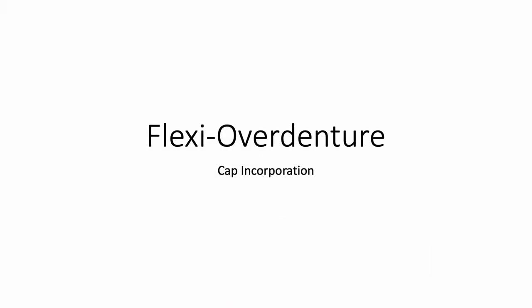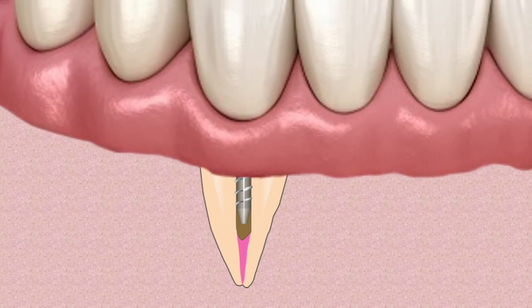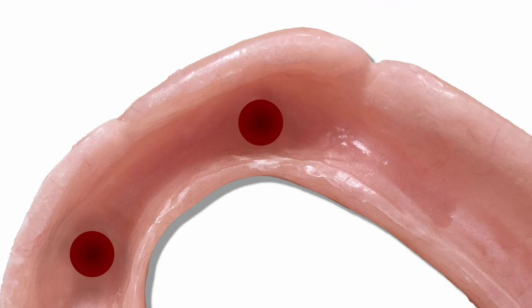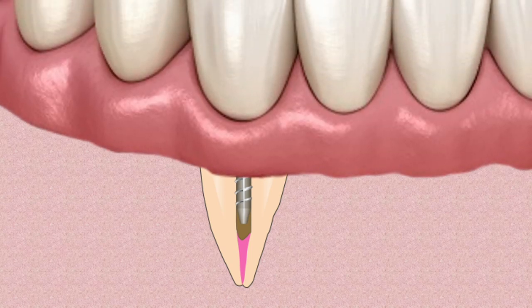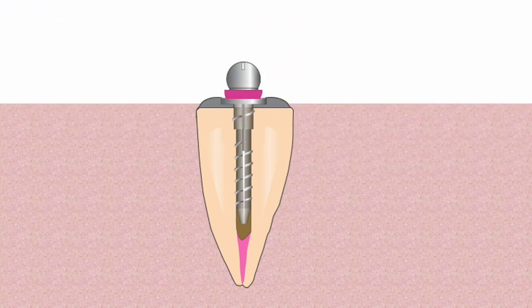Now let's review the procedure for incorporating the denture attachment. Make sure the rubber band is covering the height of contour of the head. If not, there is a risk that the cold cured acrylic could lock in under the head, making removal of the denture difficult. Place the nylon attachment cap on the post and mark the cap with marking paste. Place the denture over the ridge and remove it. The mark indicates the spot in which to relieve acrylic in the denture. Repeat this procedure until the denture fits passively over the cap. Now place cold cure acrylic into the relieved portion of the denture, place over the ridge, and let set. Use a natural pink self-curing acrylic in case there is any perforation of the denture. Remove the denture when set, then remove the rubber band on the post and discard it — it is no longer needed.